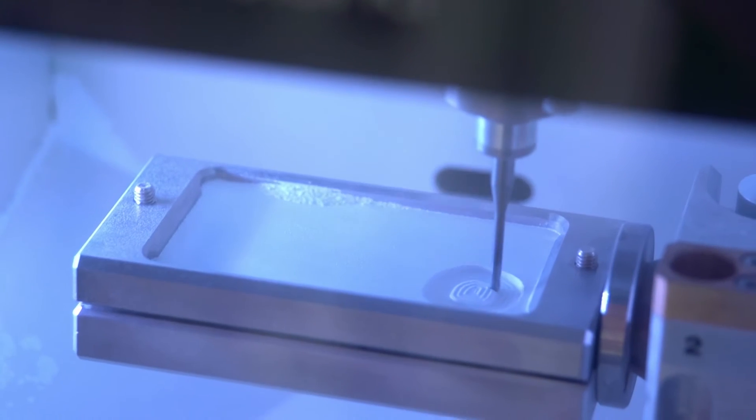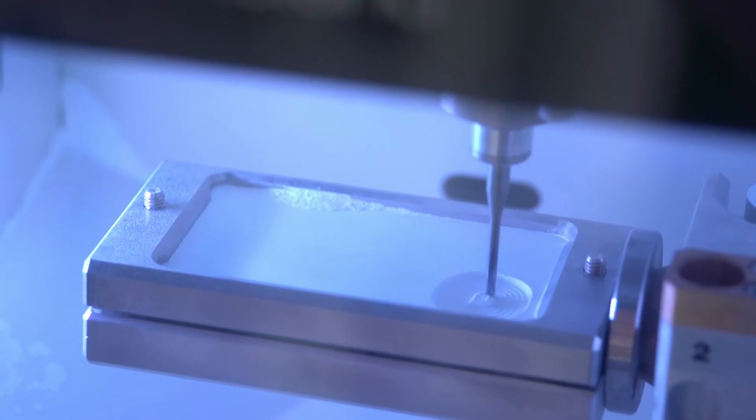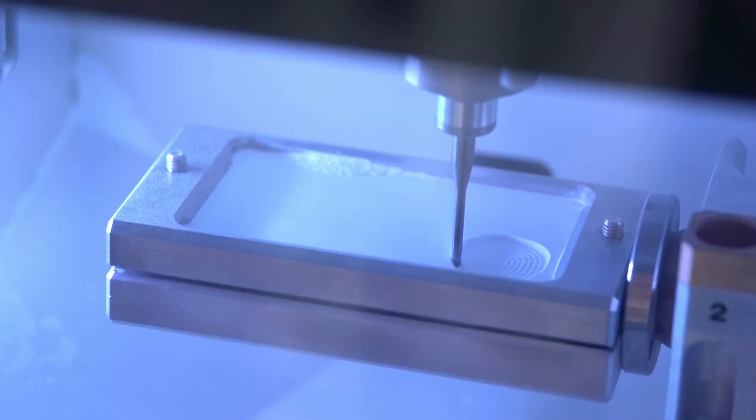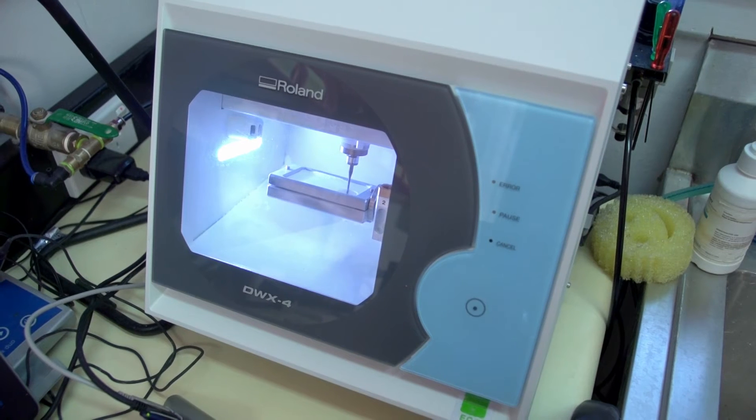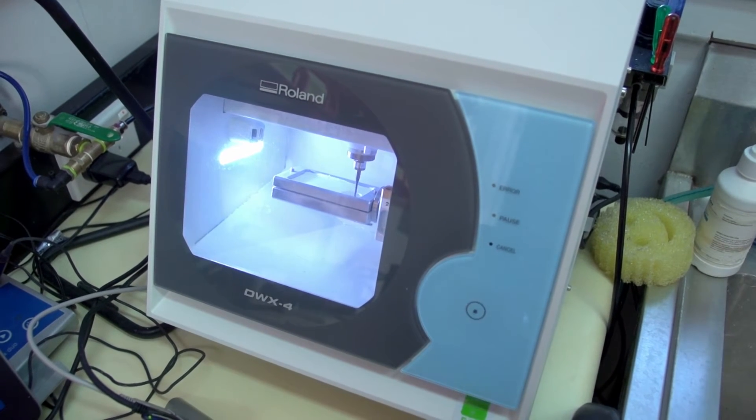We also mill out prototypes for restorations. And so I'll mill out a prototype, place it in the patient's mouth and then allow them to live with the proposed restoration. Having the DWX4 allows me to make a variety of PMMA restorations in both single colour and multi-colour so that the patient can have a realistic prototype.